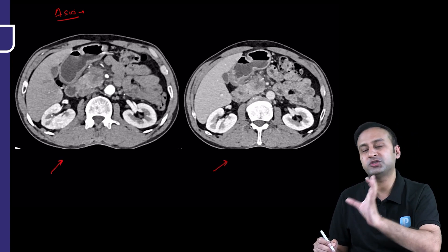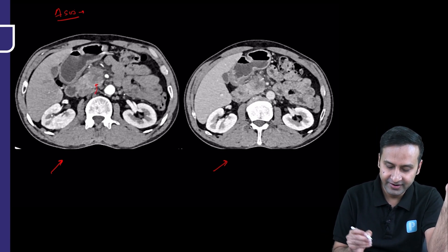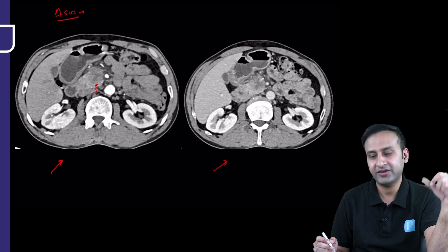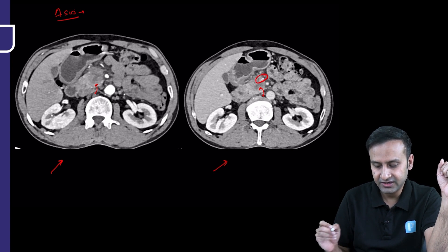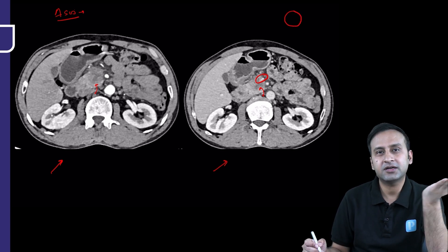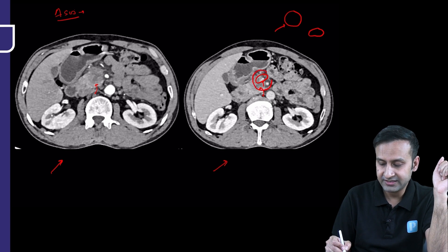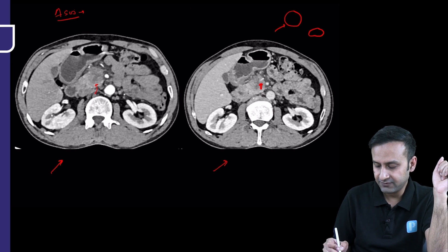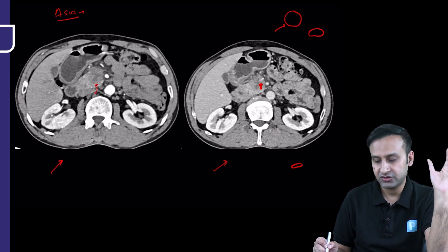Looking at two static images chosen to show the morphology: there is an ill-defined, irregular area of hypo-enhancement in the pancreatic head and uncinate process. We're calling it a mass because the lumen of the SMV is significantly narrowed — almost occluded. Normally the SMV would appear as a round or globular structure in cross-section, but here the lesion is encasing the SMV, reducing it to a small slit-like appearance. This confirms a malignant lesion due to vascular invasion.